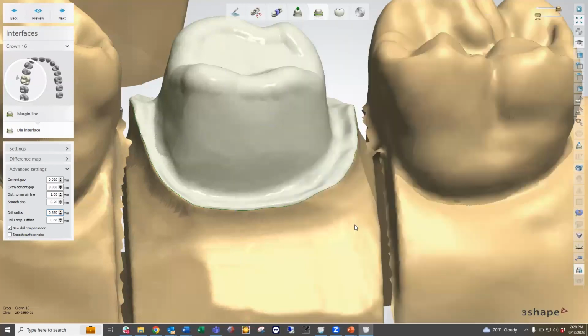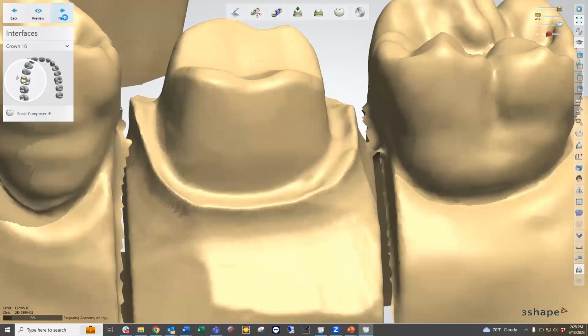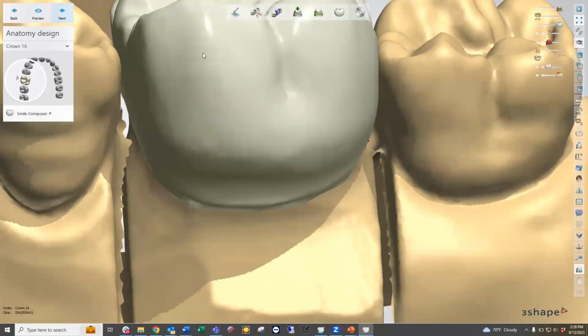So now that we've got that out of the way, we understand how important the margin line is and what the die interface does relative to the crown design. We can now move on to the next stage, which is the actual designing stage. In the anatomy design stage, we have the Smile Composer.